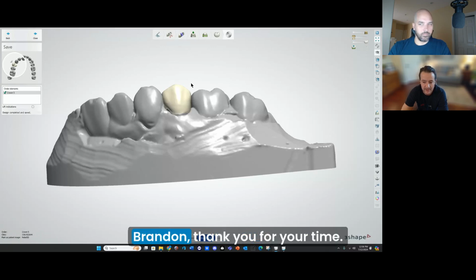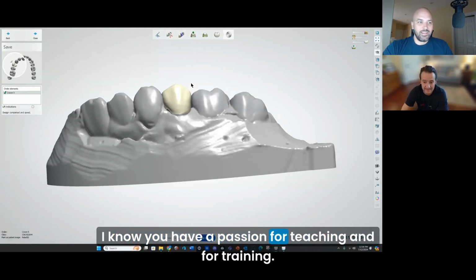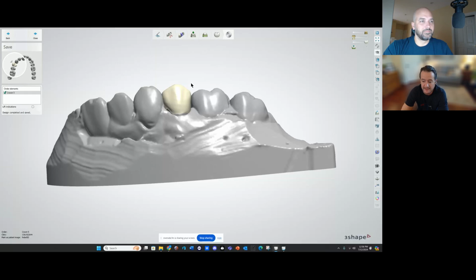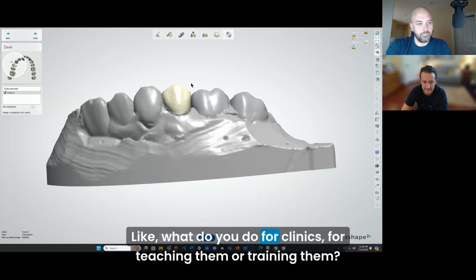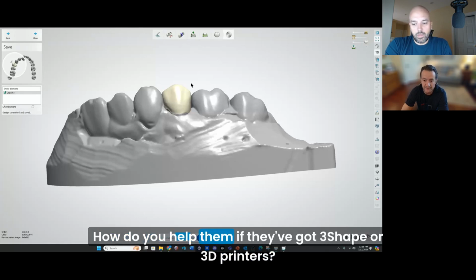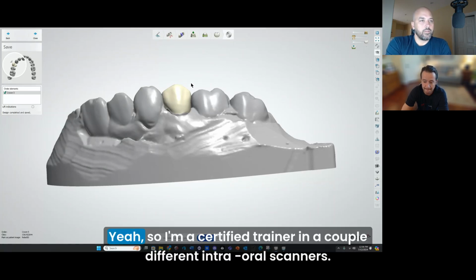Amazing. Well, Brandon, thank you for your time. Doing 10 or 20,000 of these, you've learned a few things. I know you have a passion for teaching and for training. Tell me a little bit about that. What do you do for clinics, for teaching or training them? How do you help them if they've got 3Shape or 3D printers? What kind of services do you offer to doctors who need help with their digital workflow?